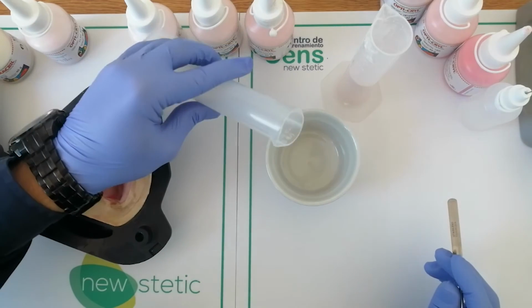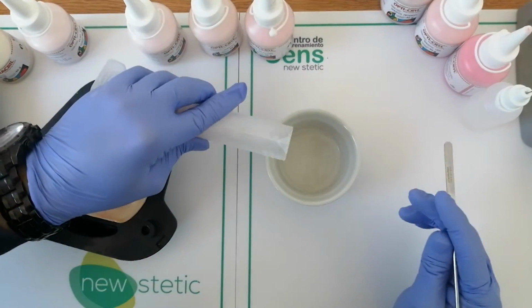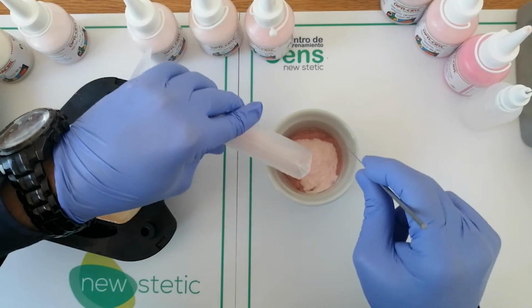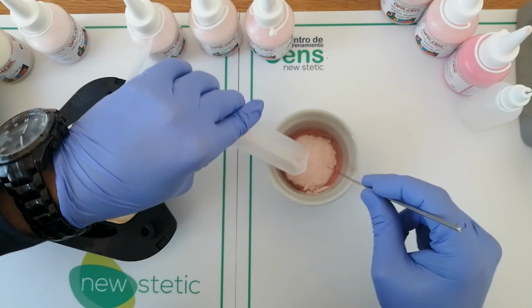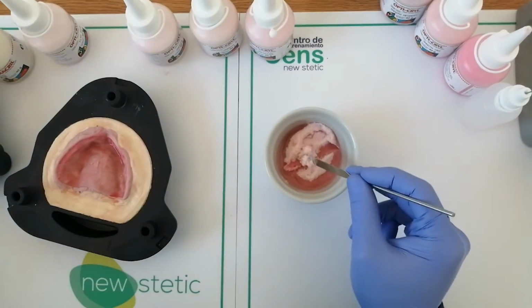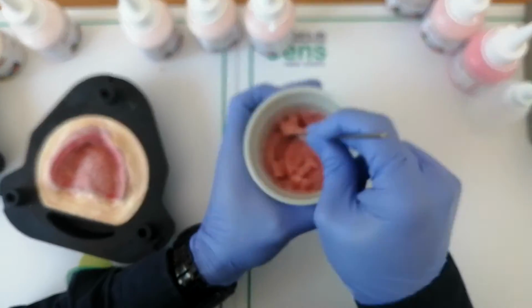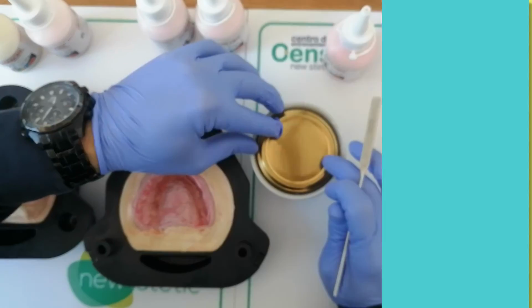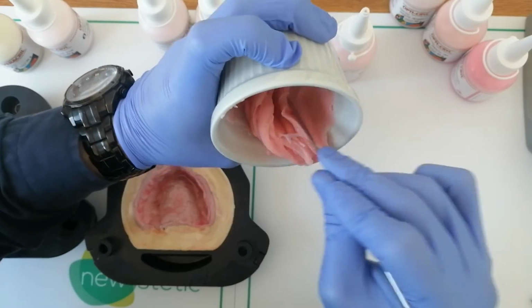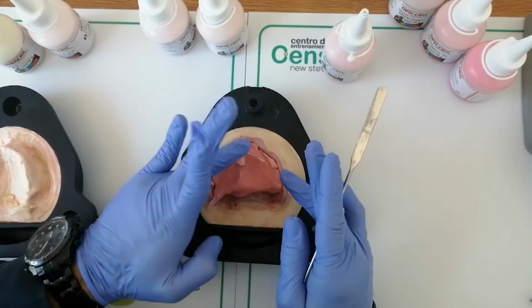First, pour the monomer in the container and then the polymer to ensure that each polymer bead is moistened with monomer and blends the color in an appropriate manner. Mix in a crisscross pattern for 30 seconds to avoid incorporation of air in the mix, avoiding the presence of bubbles in the acrylic resin. Cover the container to prevent the monomer from evaporating and the acrylic resin from losing its properties. Just keep in mind that for the microwave technique, wait until the mixture reaches the dough stage to start with the packaging process.